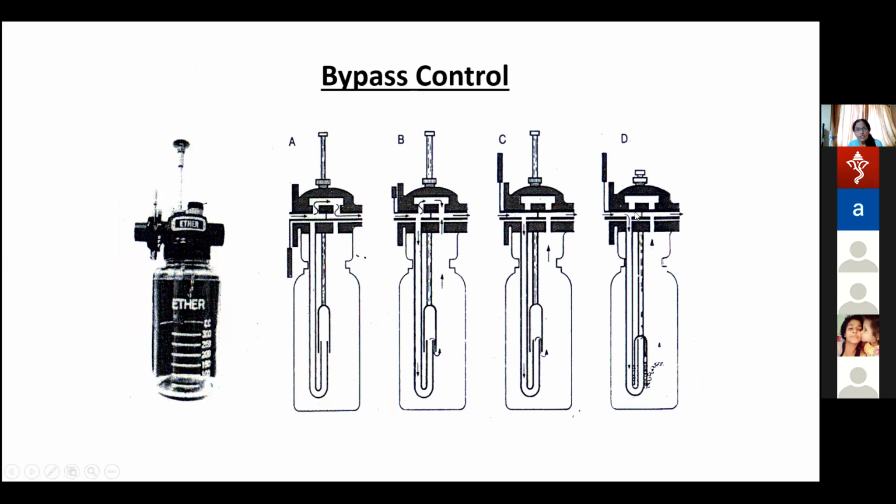Now this bypass system is such that part of the gas goes like this, and depending on how my setting is, partly they go here and partly they go here. It is such a narrow passage that resistance is very high. That's why you have to supply gases under pressure, say, for example, from the flow meter.